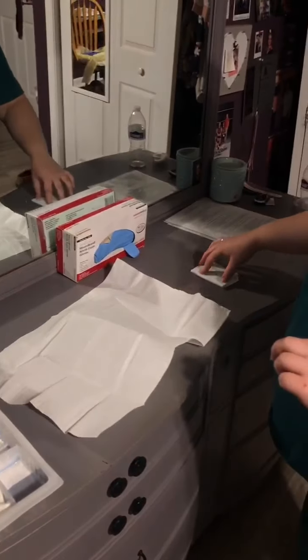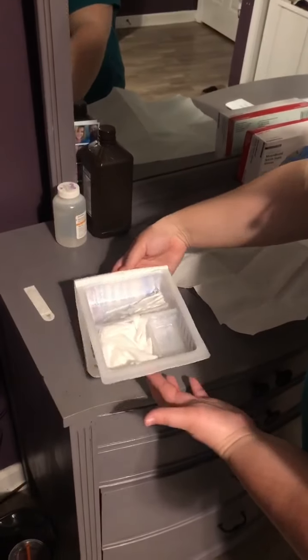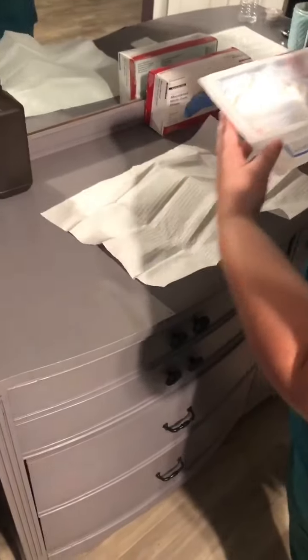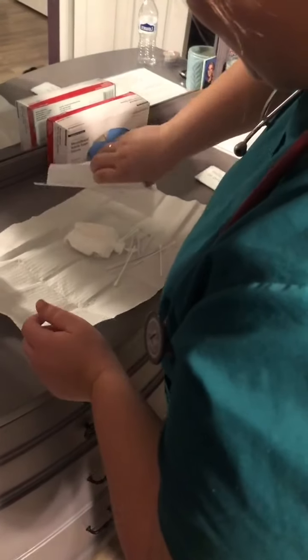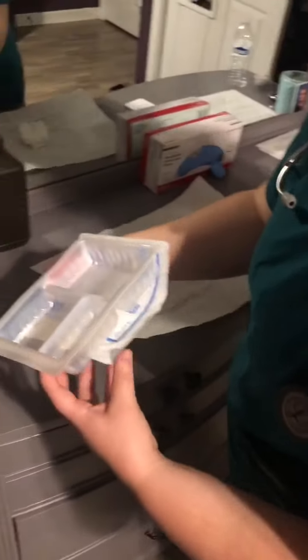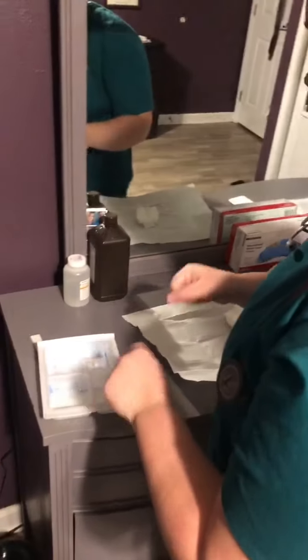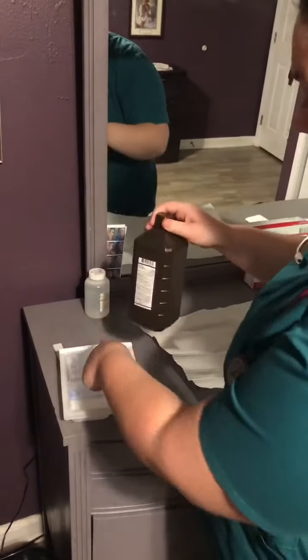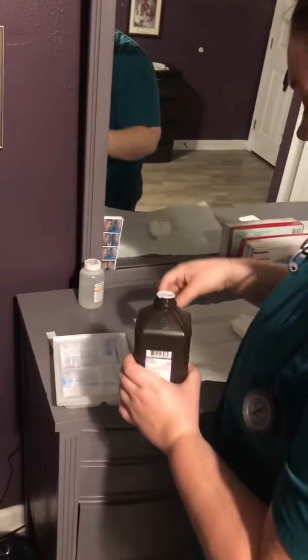Okay. So next thing I'm going to do is take the supplies and dump them onto my sterile drape. Okay. And then I'm going to set this back down. So now I'm going to fill my container here. First one is going to be half hydrogen peroxide, half normal saline.